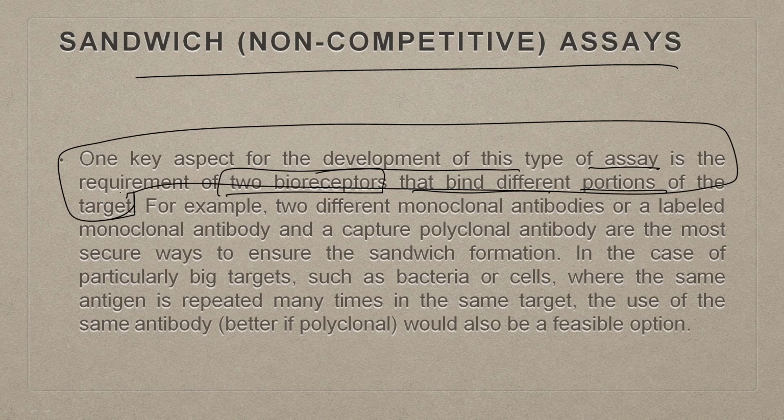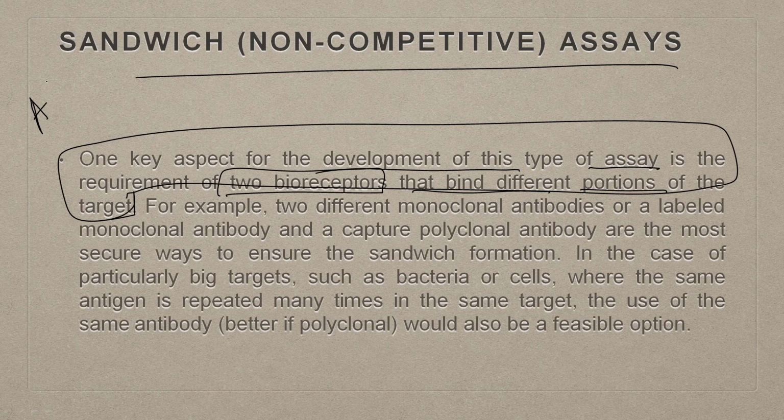Let us take a simple analogy. Whenever you go to a doctor and the doctor says you are suffering from, say, diarrhea or some disease, your friends will tell you to take a second opinion, talk to another doctor and see what that doctor says. In a way, in order to confirm that you really suffer from disease X, you are taking multiple opinions. Exactly the same thing: a molecule has multiple binding sites. Say, talk about molecule A, and suppose this molecule is something like this. It has a binding site out here and it has a binding site out here.